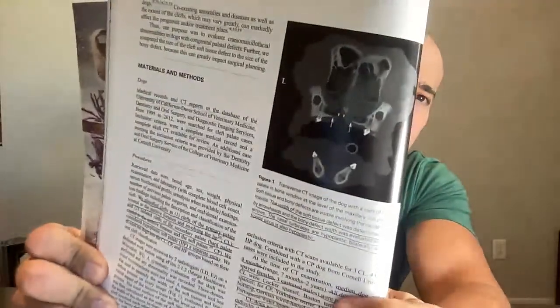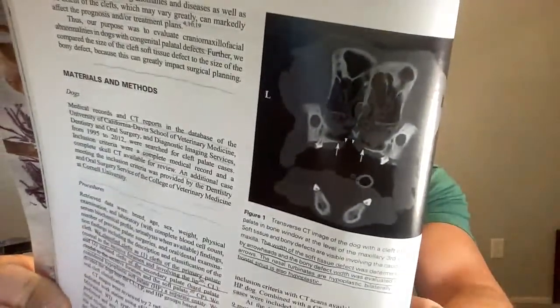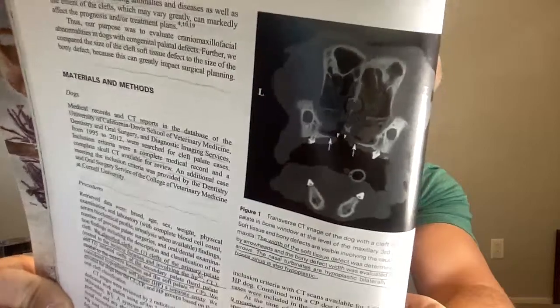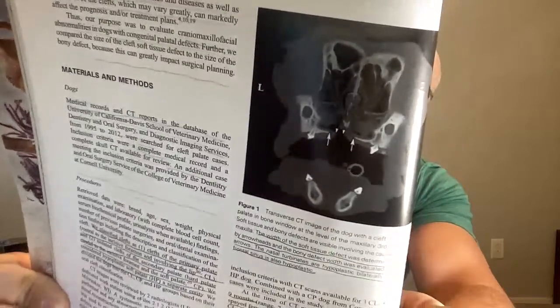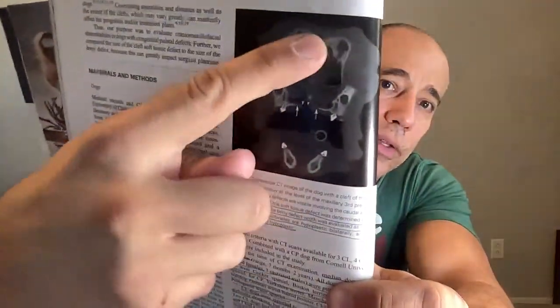Here's a CT scan, if I can show you. There you go. So you can see the arrowheads, that's the cleft palate, the soft portion. And then you can see the arrows are the bony portion. It's cleft. And this patient also has abnormalities in the nasal turbinates and that right frontal sinus. I'm going to show you all the way over there. Right there, this guy is malformed and small.